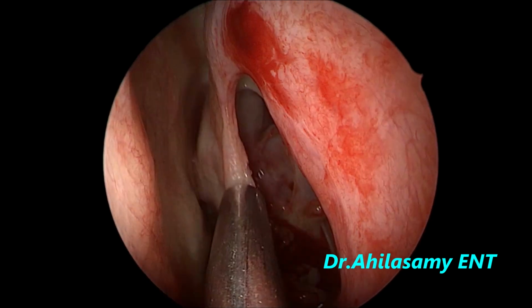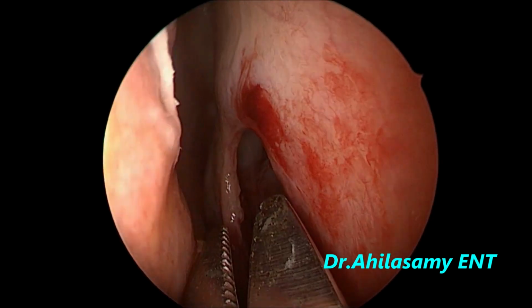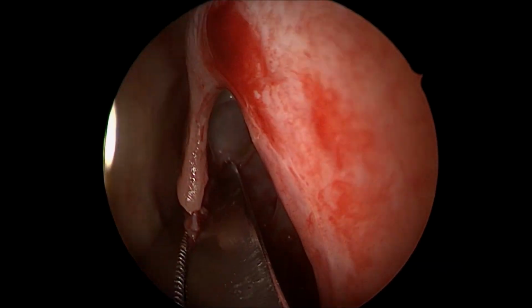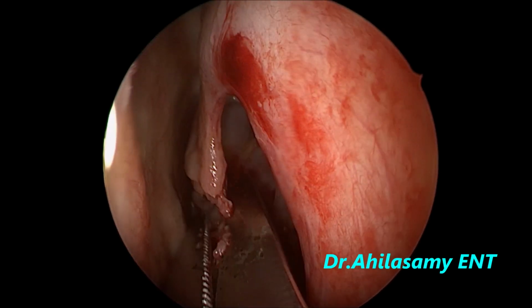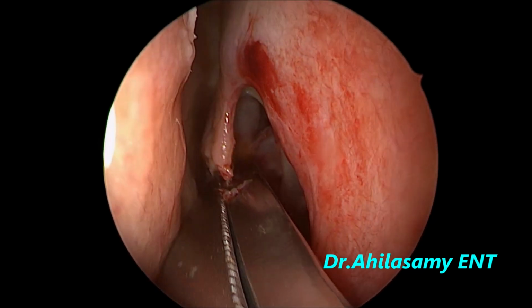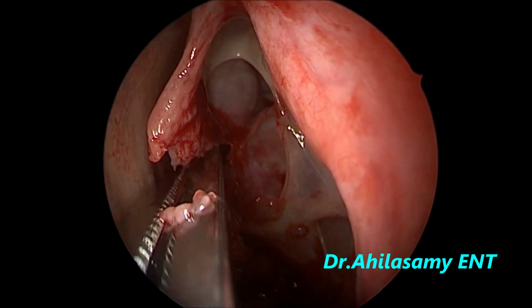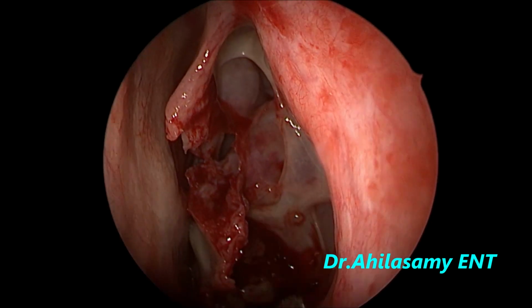The bulla is being thinned out, the middle turbinate is thinned out, and I know this papilloma is attached to the lower part of the middle turbinate, so I am resecting the lower half of the middle turbinate with a margin of around 5 to 6 millimeters. Quite a good margin I have given.